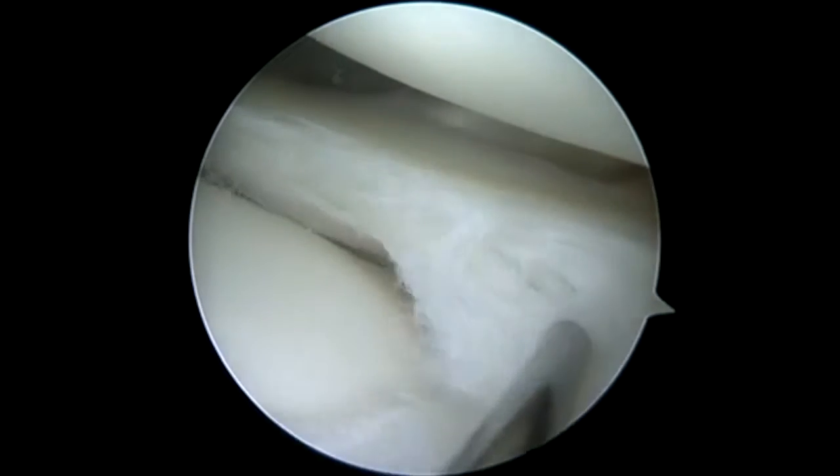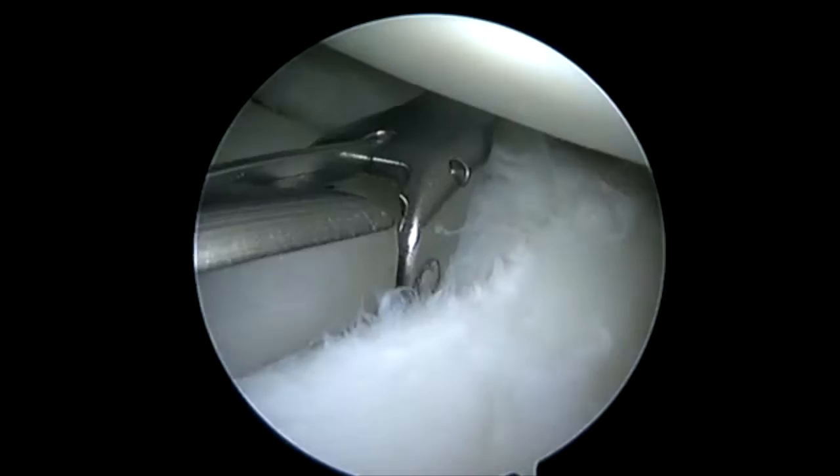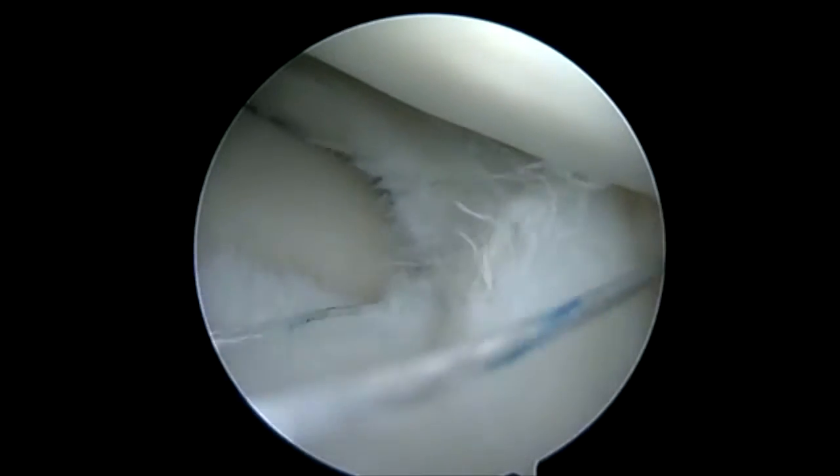Here we're tripping this horizontal cleavage tear in the lateral meniscus. She's actually got a little bit of cystic appearance of that posterior horn lateral meniscus. We did get some fluid out after we had trephinated it, so we're going to go ahead and repair that with our Nova Stitch Plus.